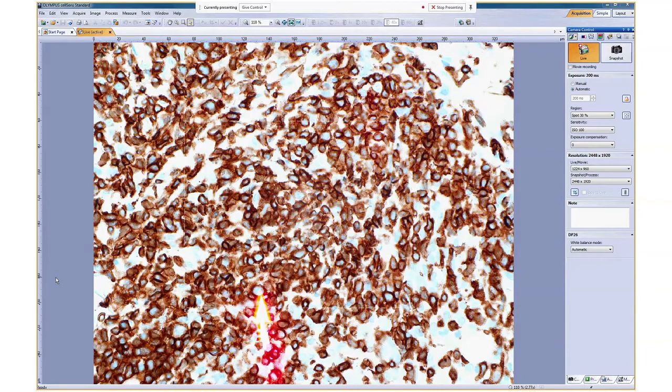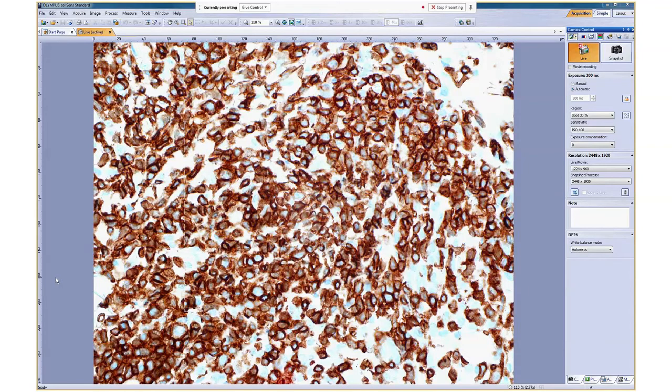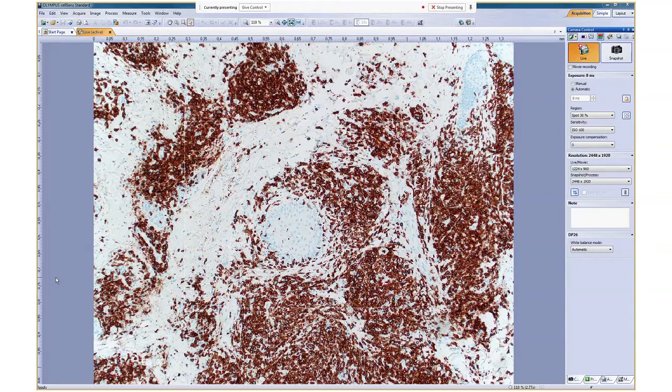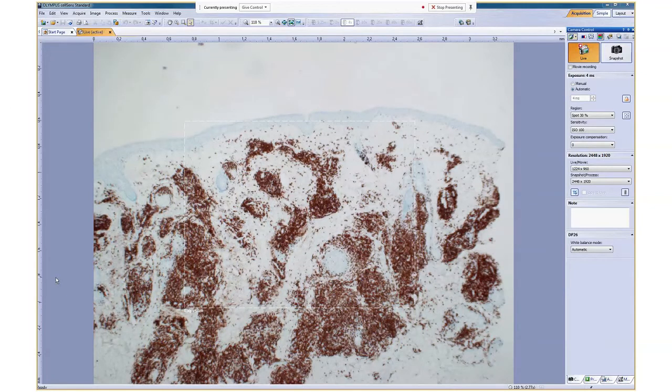They're quite large ones too. And you can have large pleomorphic lymphocytes in this entity, but they shouldn't constitute more than 30% of the infiltrate. And then you have smaller lymphocytes in the background. And then medium-sized lymphocytes. So you will see a mixture of sizes of lymphocytes. They all are CD3 positive, which is a mature T cell marker. Okay, so this is the CD3 stain. Once again on low power, so you can appreciate the density of the infiltrate.